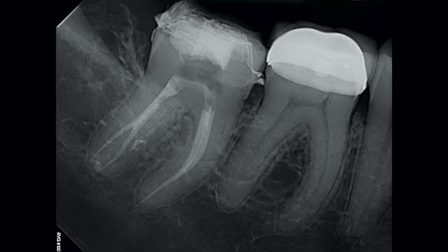This is the final result of using these techniques. This bifidity was successfully managed with little to no enlargement of the coronal portion of the distal canal, and a conservative canal shape was maintained. I'm certainly not saying this is easy to do, but this is how it's done. If you're motivated and practice these techniques, there's no reason why you can't apply them clinically.